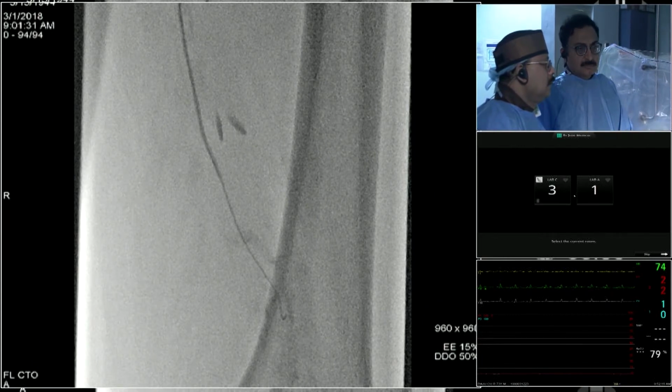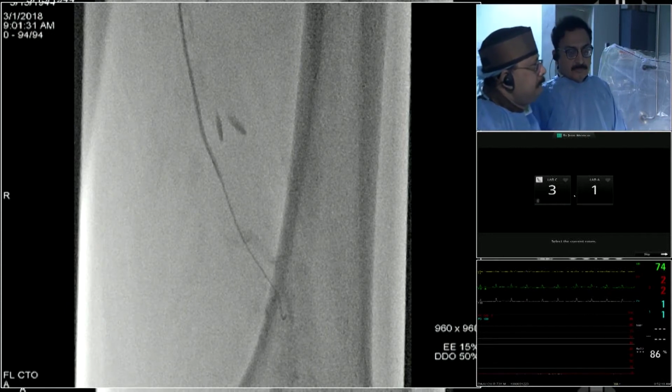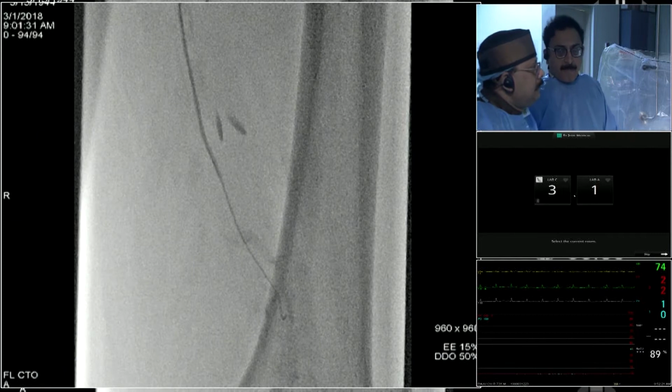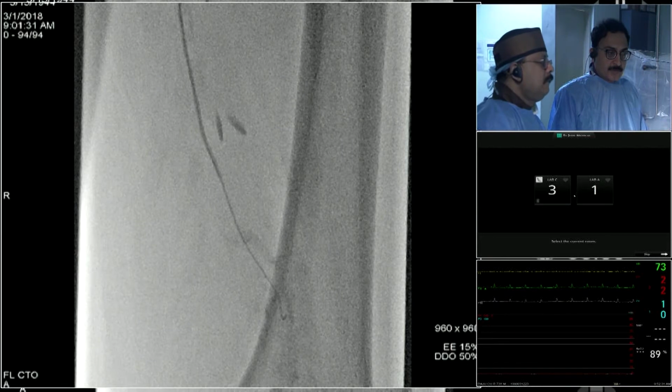Good morning, Dr. Khanna. This is Tarun Madan here, sir. In the supine position also, sir, if we can puncture the upper part of the popliteal femoral junction and just introduce a needle, don't put a sheath, cross it with a 0.035 wire in the supine position from the medial part of the thigh, and then exteriorize that wire, leave that needle in place, and then once you exteriorize the wire, balloon it, and then occlude the puncture area with the balloon itself.